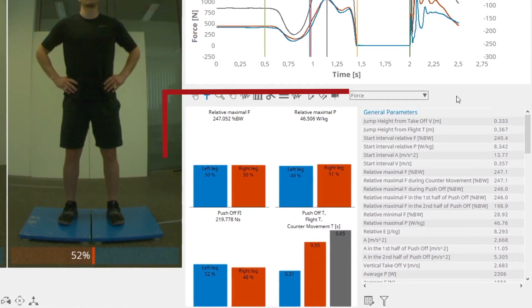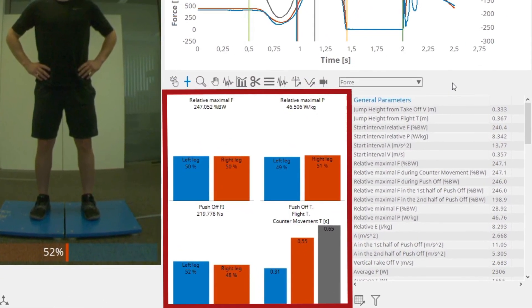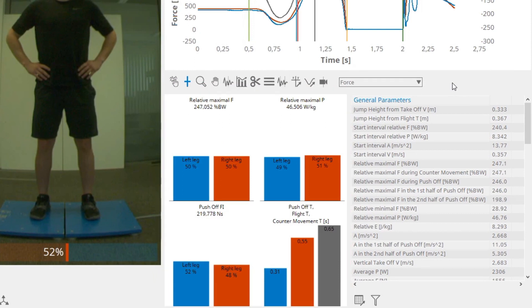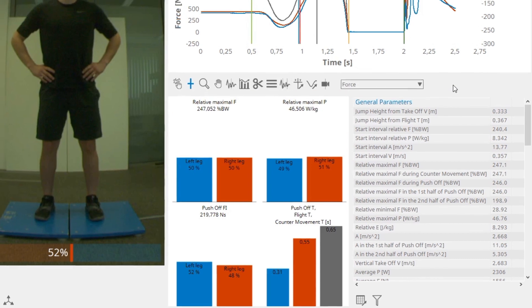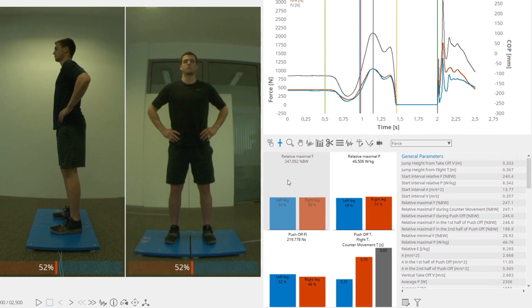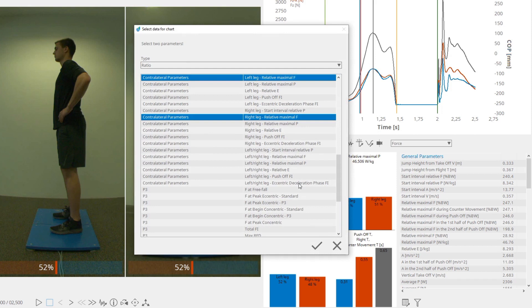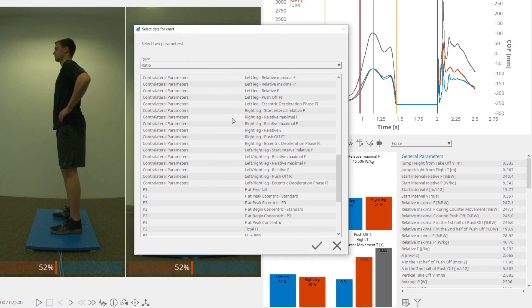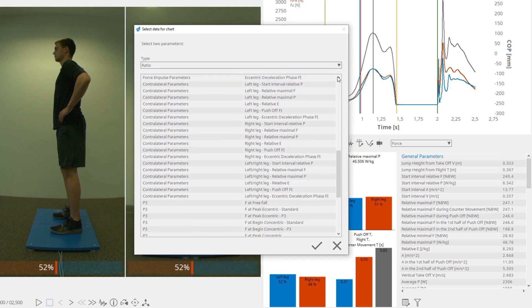In general, charts are used to compare parameters between the left and right side. Because of that, charts are visible only in cases when a measurement was acquired with two plates. You can change the parameters shown in the chart by clicking on the chart and selecting Edit. Select two parameters that you want to be shown in the chart — be aware that you can only select parameters from the same parameter type.